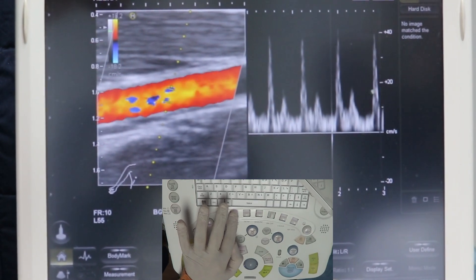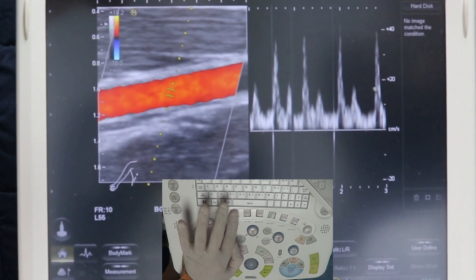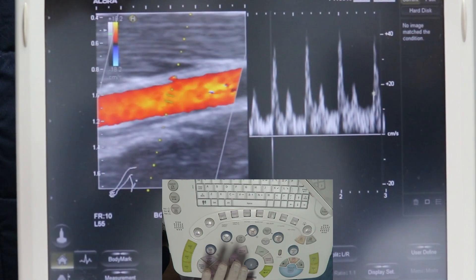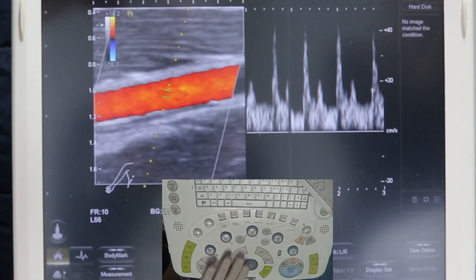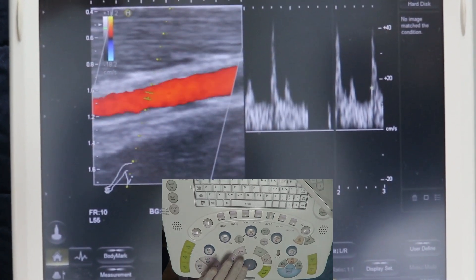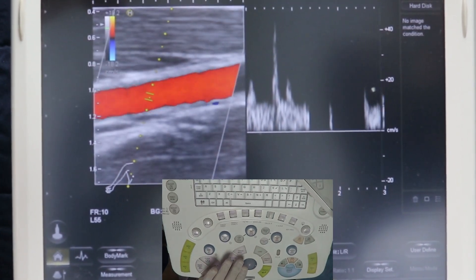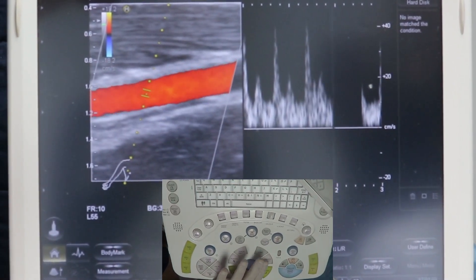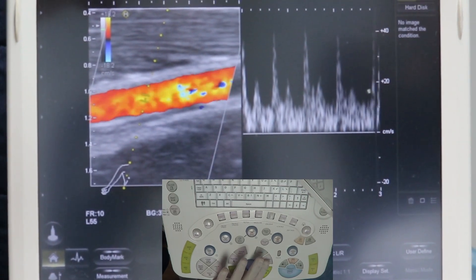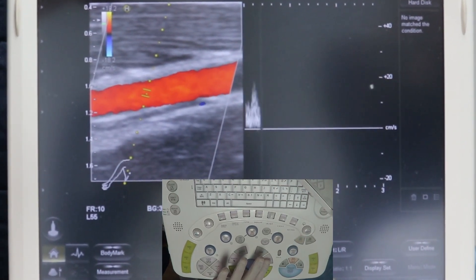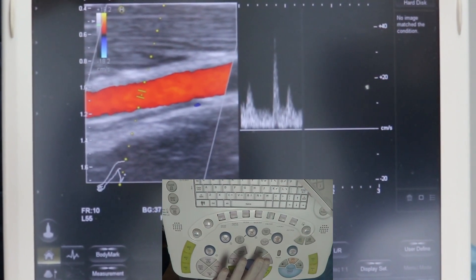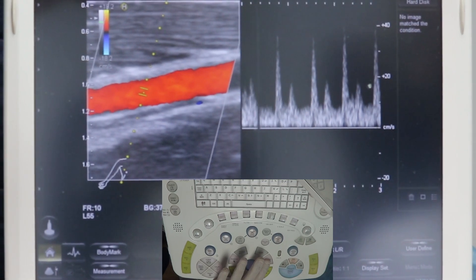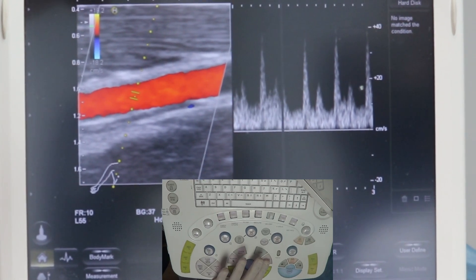you should make the sample volume as small as you can and place it inside the center of the artery. By this way, you can obtain a good color and a good spectral flow pattern.